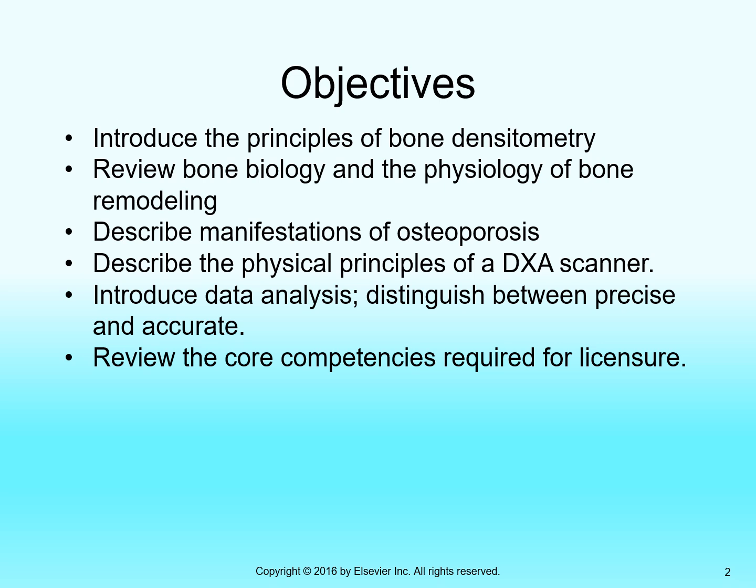That is essentially the density of calcium in the bony matrix versus 6 months down the road versus another year down the road. And is the calcium score decreasing over time, or is it increasing over time, or is it staying the same? Decreasing over time gets you into a diagnosis of osteoporosis, and the doctor might take that result and say, okay, well, we need to do this and this.